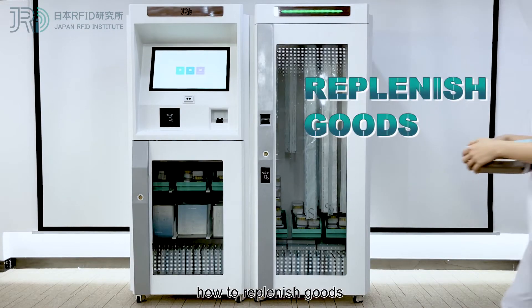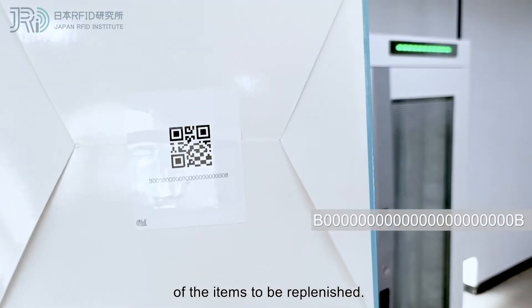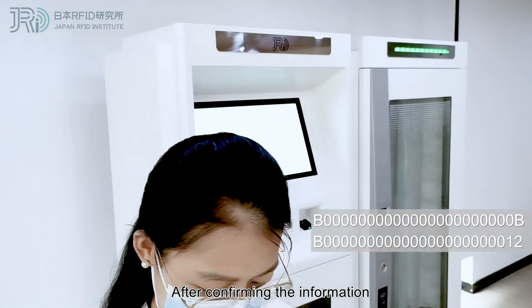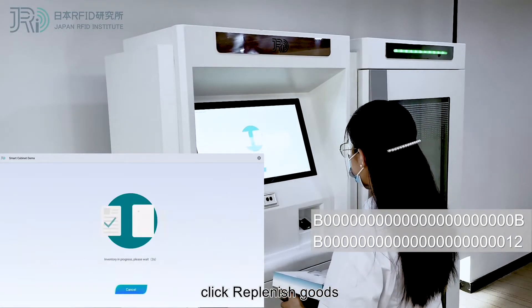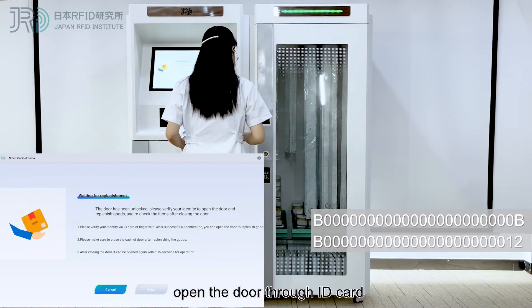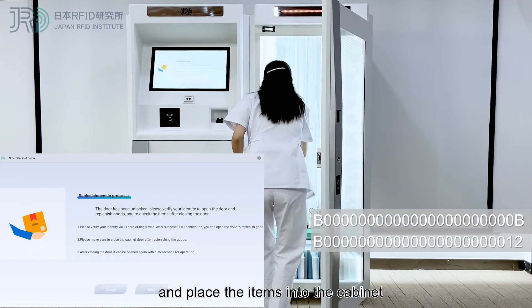We're going to show you how to replenish goods. First, we keep a record of the items to be replenished. After confirming the information, click Replenish Goods. The system will start to take inventory. After this, open the door through ID card or finger vein, and place items into the cabinet.